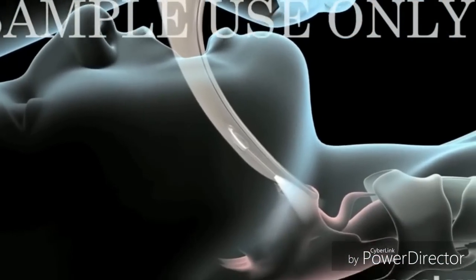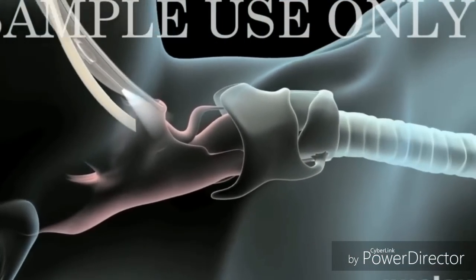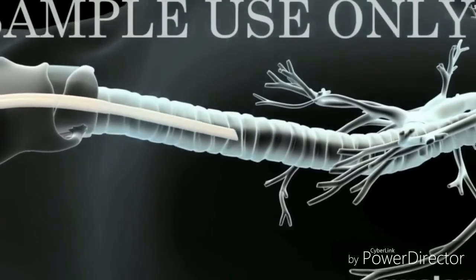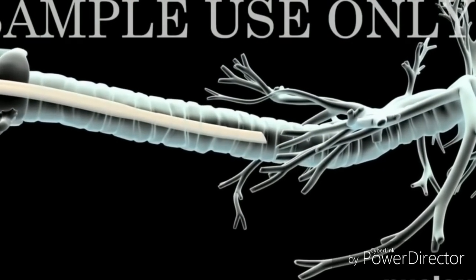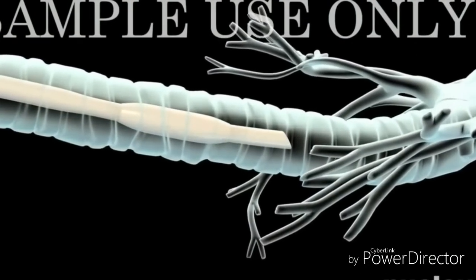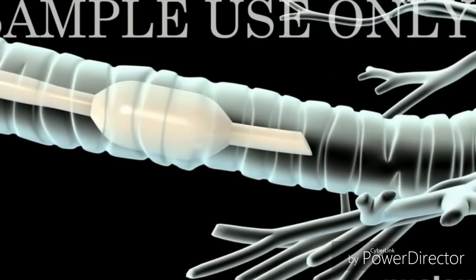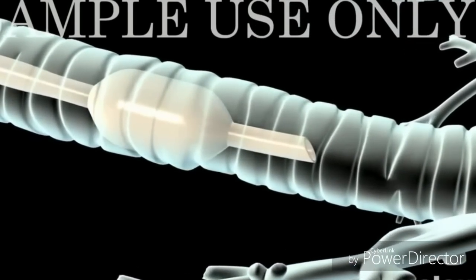Now introduce the endotracheal tube into the trachea. After the introduction of the endotracheal tube inside the trachea, you are supposed to inflate the cuff (bulb) which is present distally at the end of the endotracheal tube.